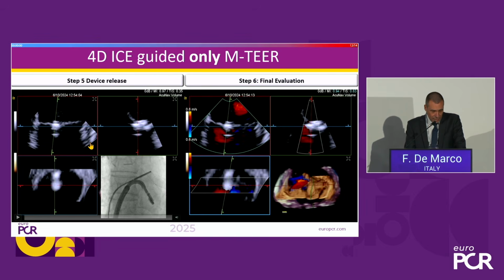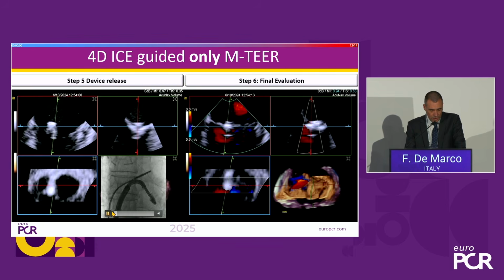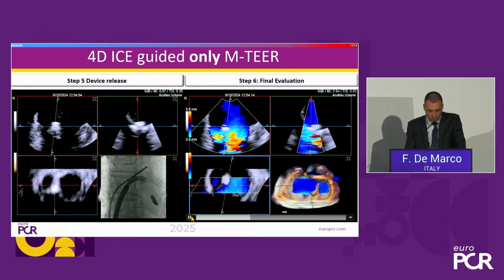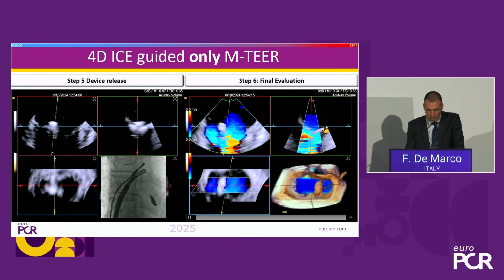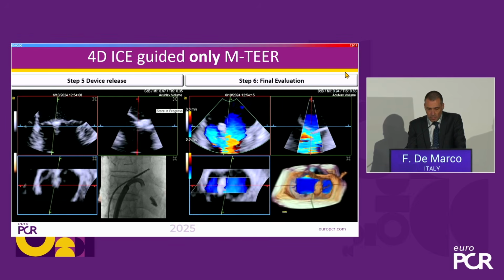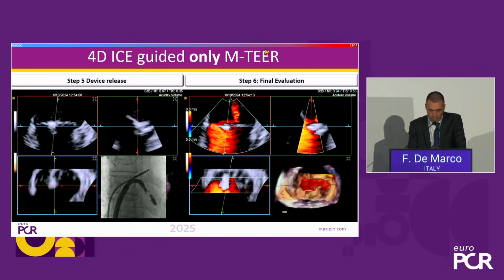This is the device release step. We basically disconnected the Pascal, and then we checked again for our final result. There is a small residual jet next to the implant, a very minor residual mitral regurgitation.